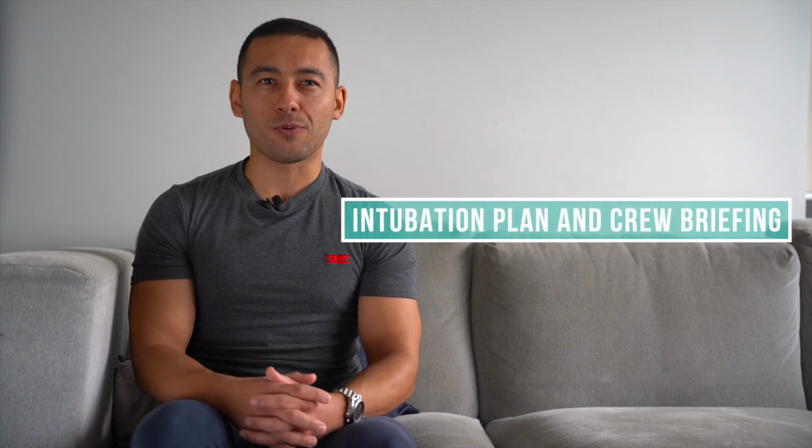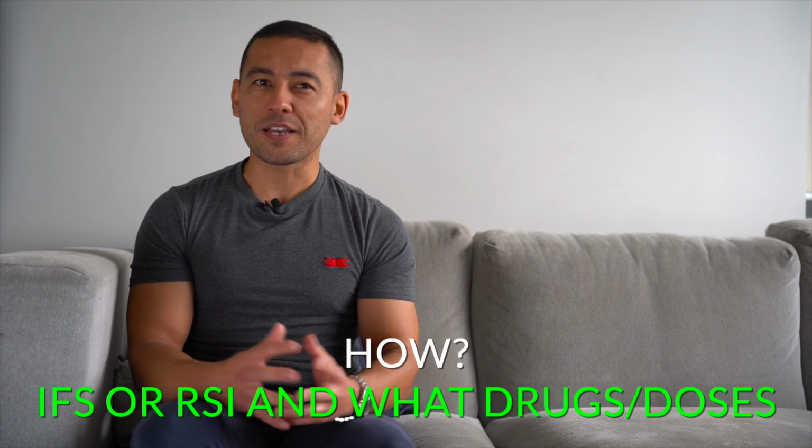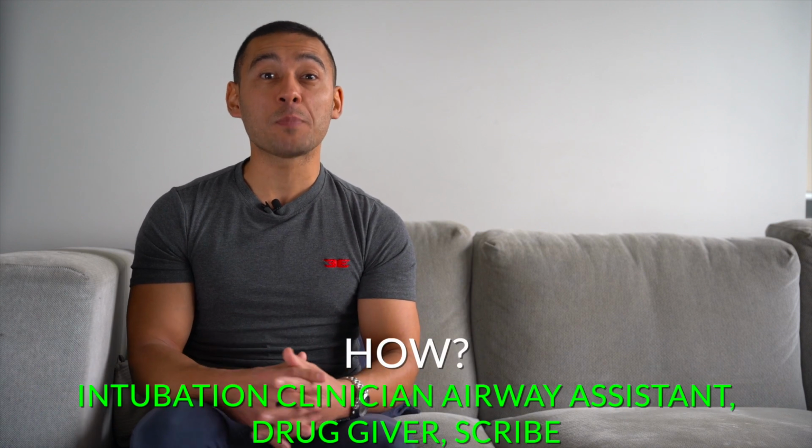When it comes to briefing the crew, it is important to do it early and with clarity. Everyone on scene should understand the decisions surrounding a drug-facilitated intubation, including why is the patient going to be intubated, where are they going to be intubated, how are they going to be intubated, and who is going to be performing the intubation and other roles. The actual delegation of roles can depend on a variety of factors, including the number of paramedics available and their clinical rank. However, in general, if you are the intensive care paramedic performing the intubation, then your ICP colleague will be your airway assistant. One ALS paramedic will be tasked with administering drugs, while the other scribes and verbalizes what is on the monitor.